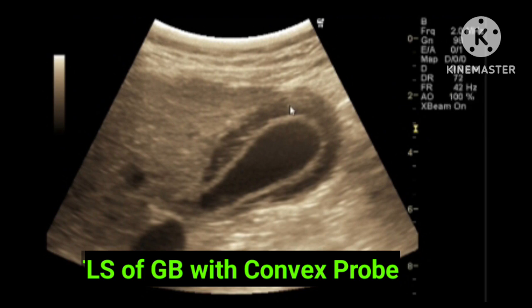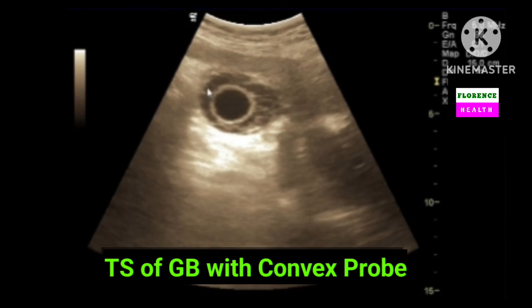Again I am telling, in inflammatory conditions all these three layers are easily visible, but in normal cases these three layers are not seen. Sandwich appearance of the gallbladder wall is in favor of acute cholecystitis.